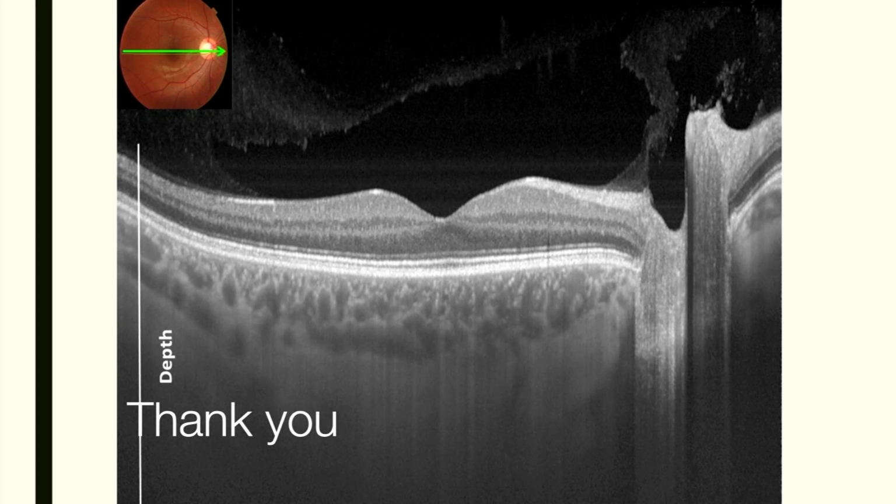Montage is not that easy to get. And even with the Cirrus 6000 that I have, max is 12 by 12. It doesn't go beyond it. You have to have the swept source OCT to go beyond it, or the newer OCTs which can take you even further. So a combination of montage, if I'm really suspicious, with the fundus photograph. I don't mind doing a fluorescein angiogram also if I'm really thinking that it could be. Sometimes you see sclerosed vessels, or posteriorly you see some capillary non-perfusion areas. If you do an OCT angio, then you definitely take up the patient for a fluorescein angiogram.